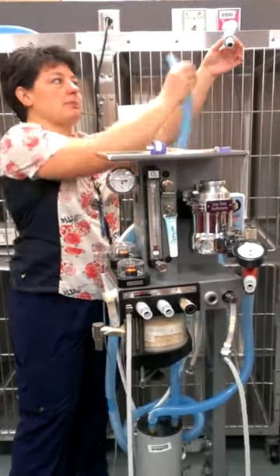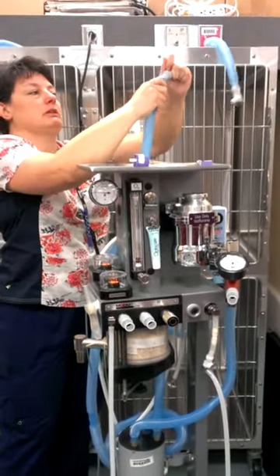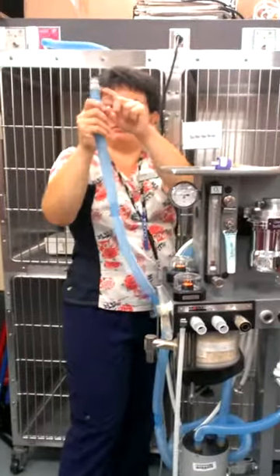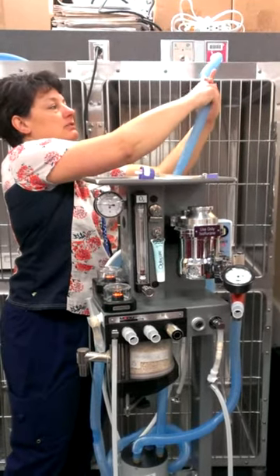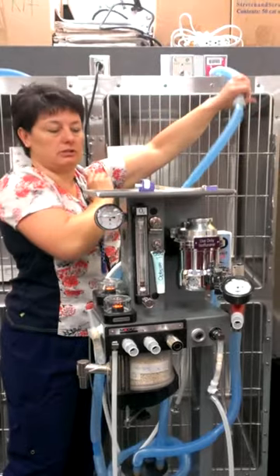Does everybody see what happened here? There's no end on here. The button should have been pushed and that should have been in. You should have one end that's got this end and the other end has the other end — you don't just yank it apart. They actually click together. Y'all heard the click.